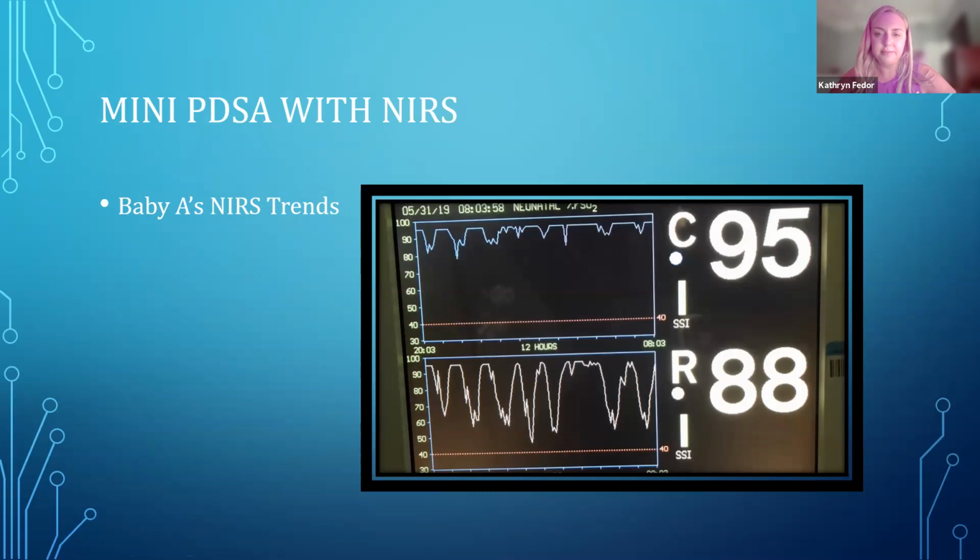And this NIRS pattern was quite interesting to me because first of all, there was definitely a little bit of what we saw, cerebral protection when he would drift down a little bit. You see that his renal site would plunge a lot further than his cerebral site. But also these were just very mild desaturations. So these were just his drifting to the low 90s, high 80s, that we would see these sharp decreases in his readings. And then also, we noted that his baseline was quite high.